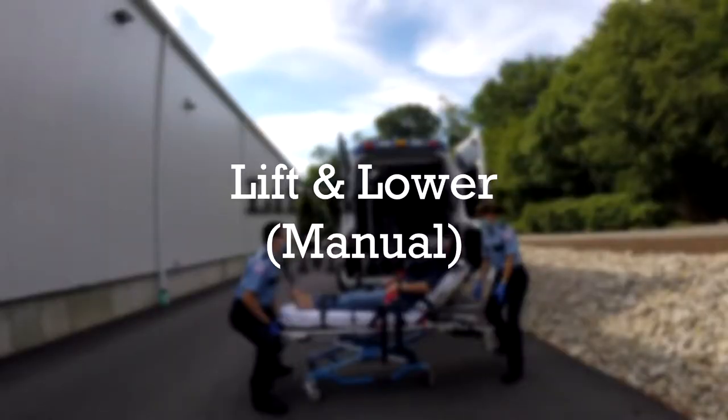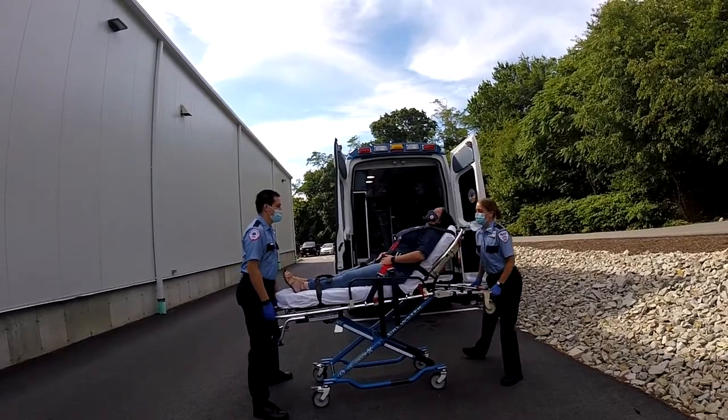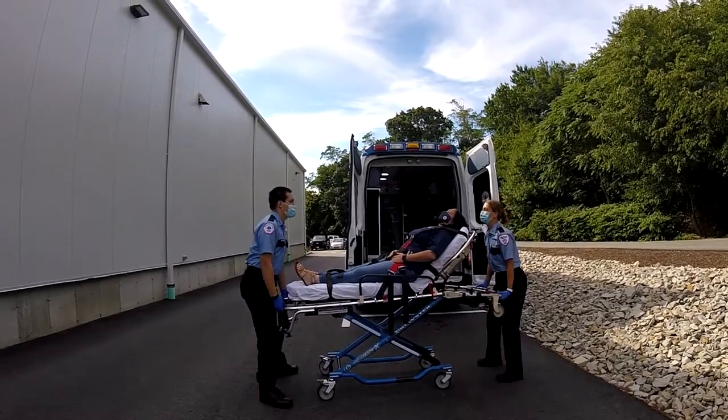Both team members should be in proper position prior to lifting the stretcher. Closed loop communication is important throughout this entire process in order to facilitate a smooth transition from the time the patient gets on the stretcher to the time the stretcher is secured for transport.